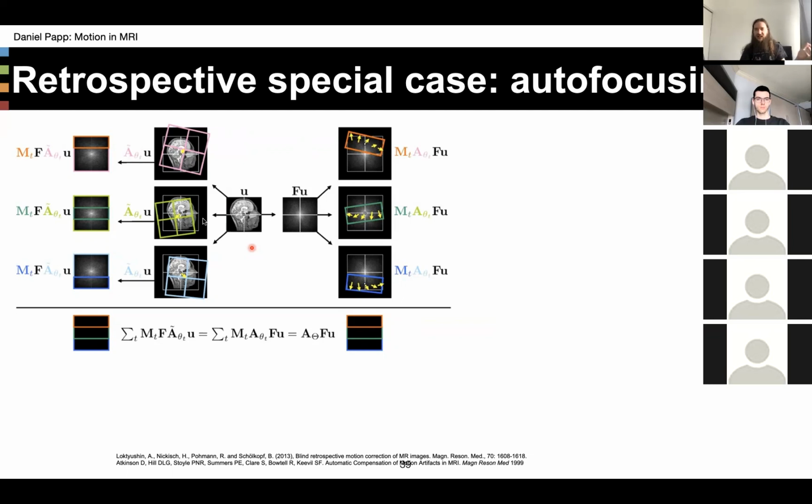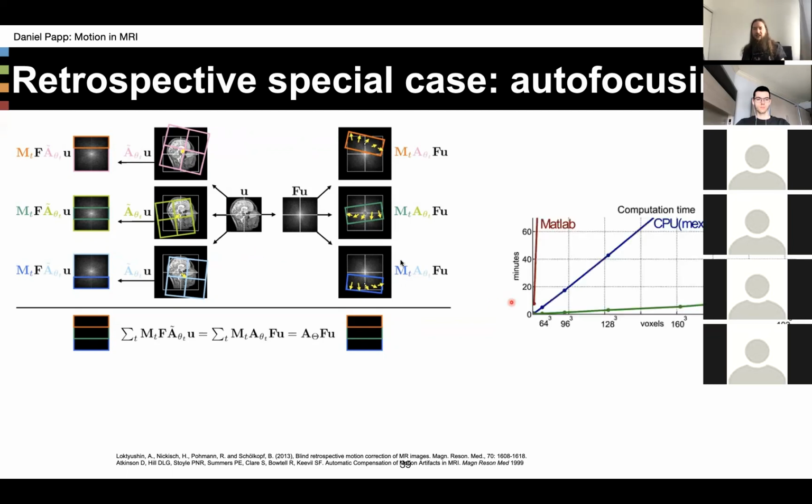The reason these haven't taken over the world is that this can become incredibly computationally expensive really fast, because you have increasing patch sizes, you have arbitrary motion trajectories to try out, and you have to do effectively non-uniform Fourier transformations there and back, there and back. So it's a cool idea, but it has massive limitations.